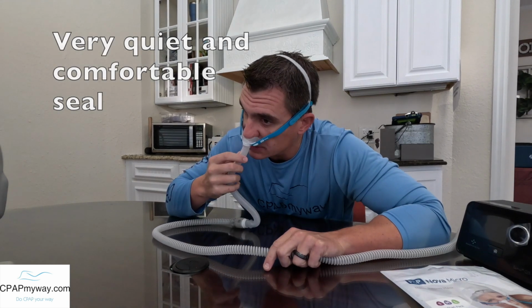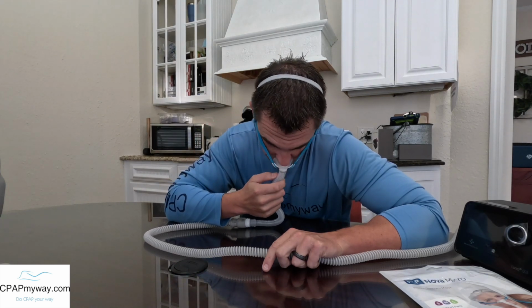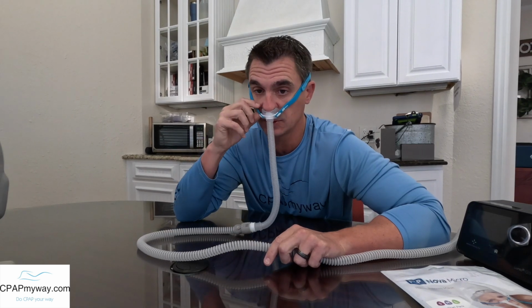It's very comfortable. It has a little bit of that inflation to it, not nearly as much as the Solo, but it has, hopefully you can see there, it rides on the nose pretty good. And you know, I'm moving it all around, and at 8 centimeters with very loose fitting, it is sealed really well, no leaks at all.